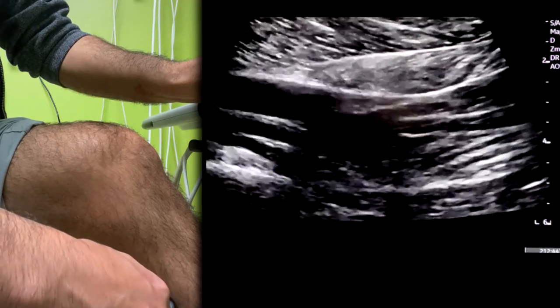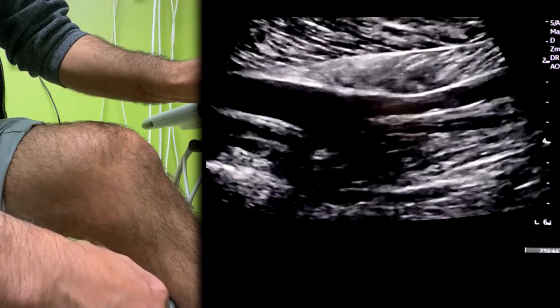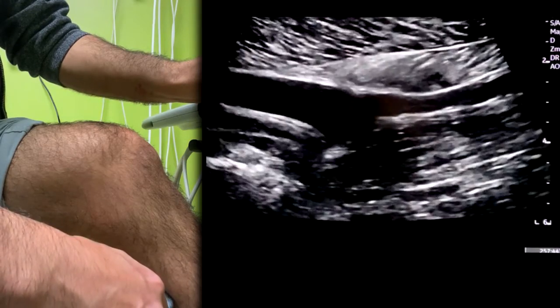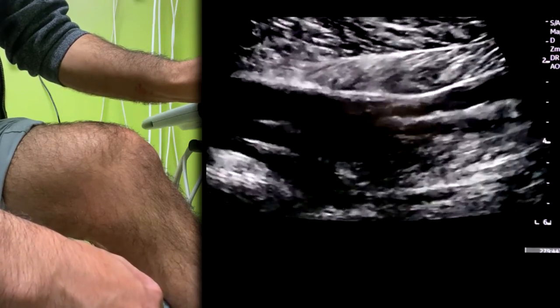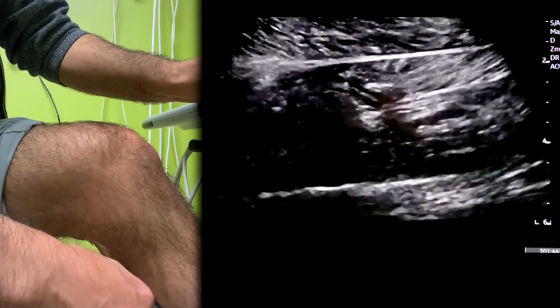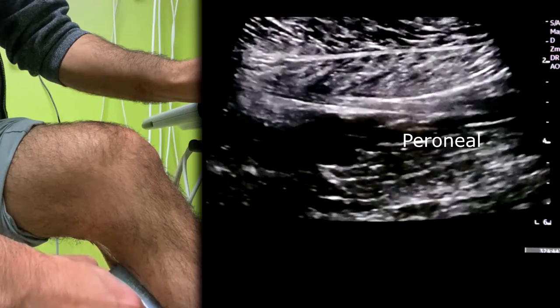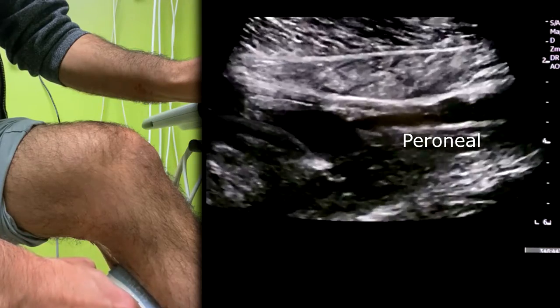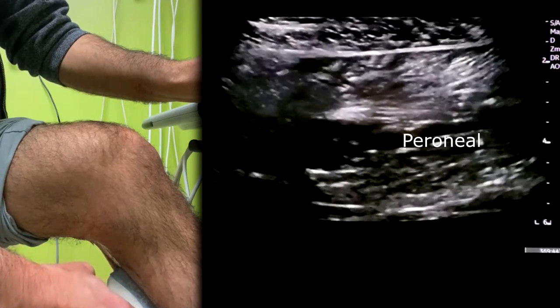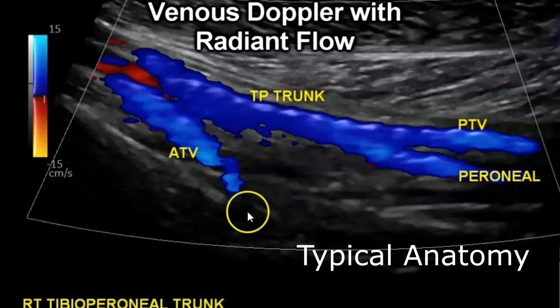In this case I have the anterior tibial vein coming off there, and then the posterior tibial vein, and then the peroneal vein also coming into the popliteal. So the trifurcation is right at the popliteal.